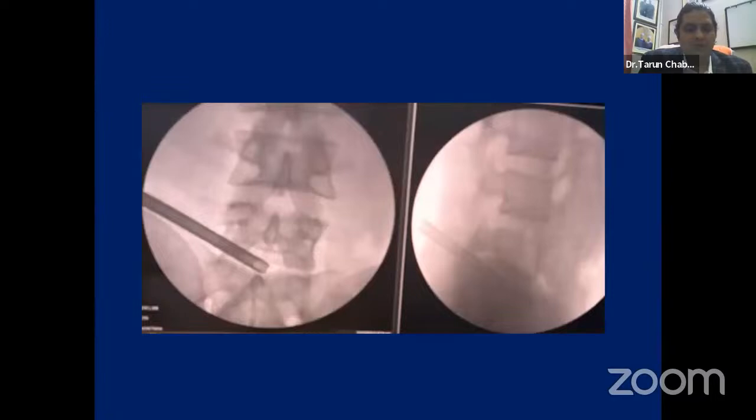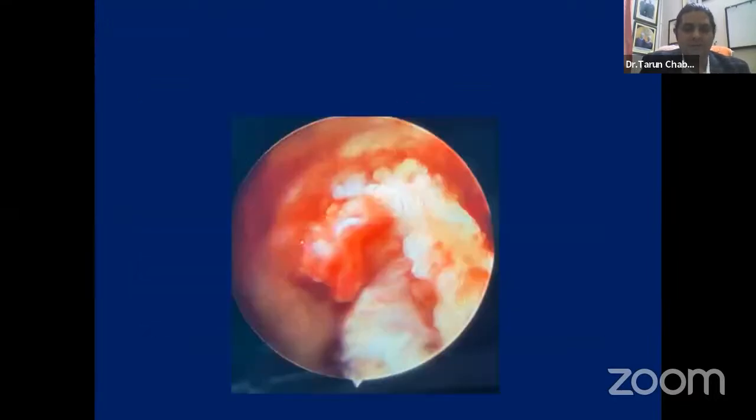So this case is L5S1. I will land up inside the disc, and first of all, in the transition from open surgery to a transforaminal technique, we land in the disc, and inside the disc, we take out the disc material and come out. This is the first image that we will get, and we take out the disc and do the intradiscal work.